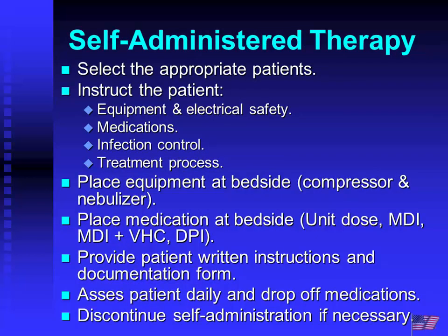Patients do have the ability in some institutions to allow for self-administered therapy. If a patient is on therapy at home and is in the hospital for a non-pulmonary reason, such as knee surgery, they still need the therapy, but the therapist doesn't necessarily have to sit and hold their hand at the bedside. You want to make sure the patient understands the operation of the equipment and the electrical safety of the bedside nebulizer, what their medications are, and what the treatment process is.